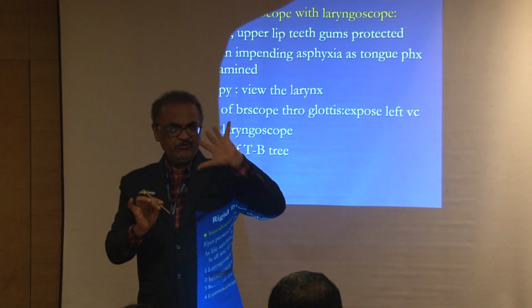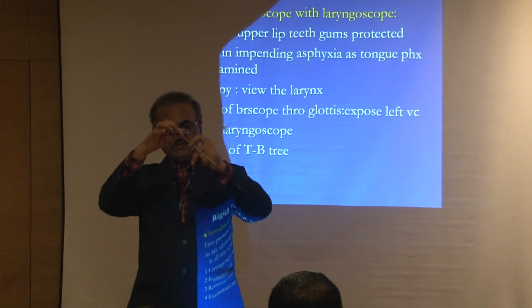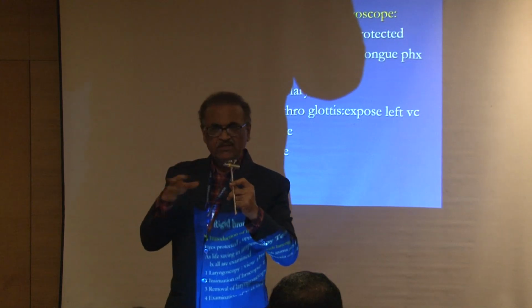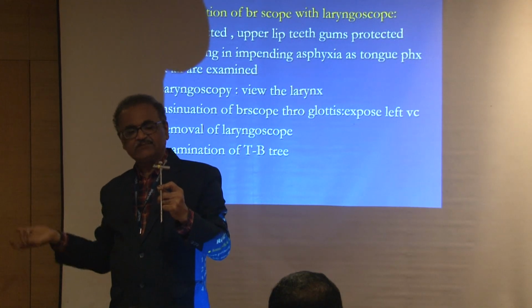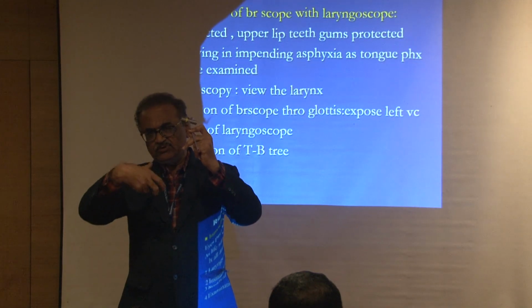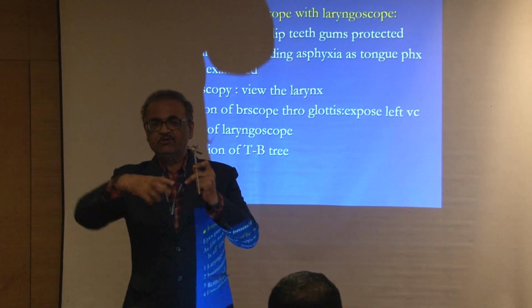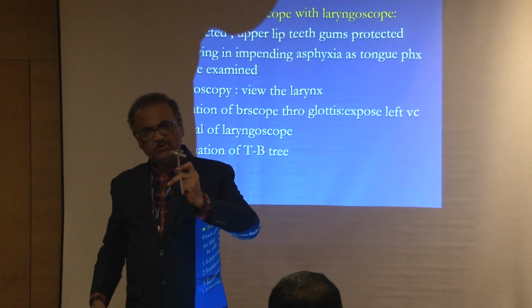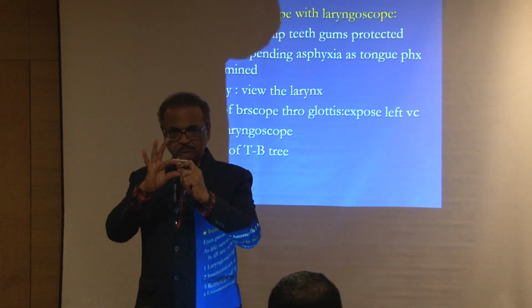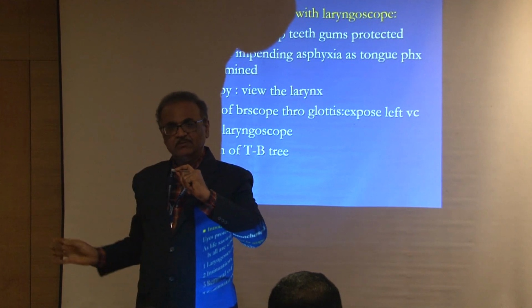Then you have the other hand free. Now change your hand. After changing, you have the right hand free. These are simple, I am just putting it in words. So this middle finger is going to hold at the palate, and this will work for extension also, with the finger, because the patient is a child. And now with these two fingers, you can pass the scope gradually deeper.